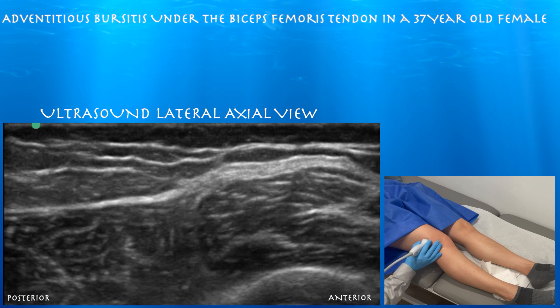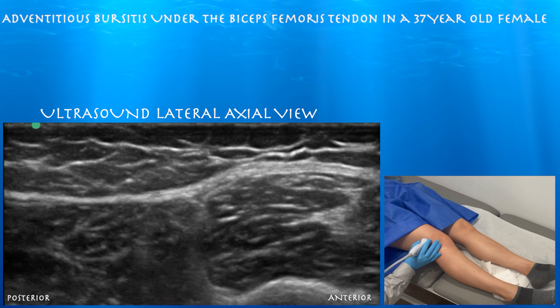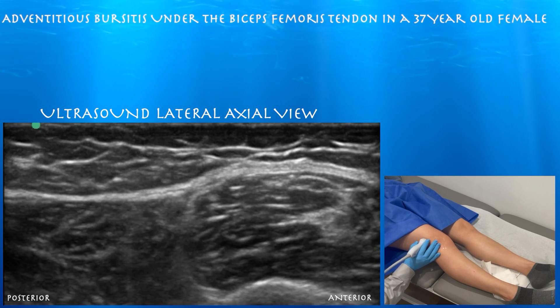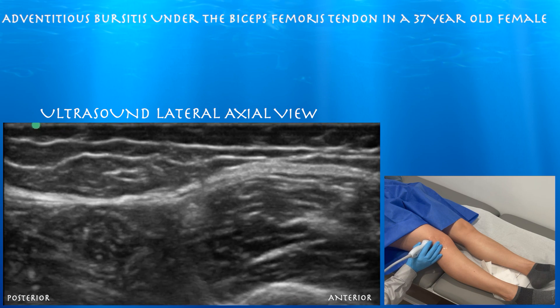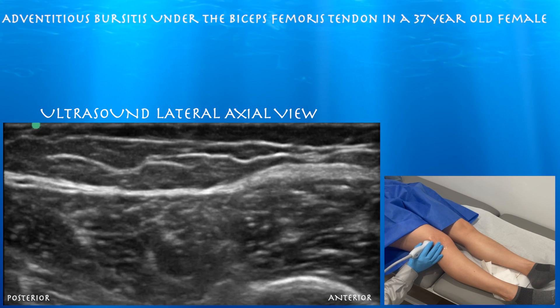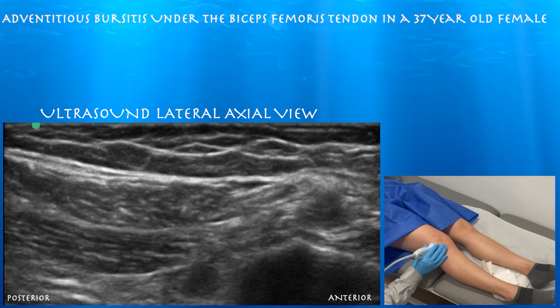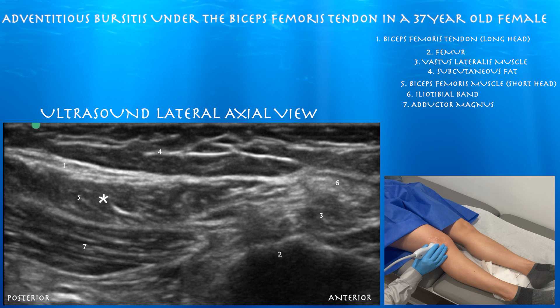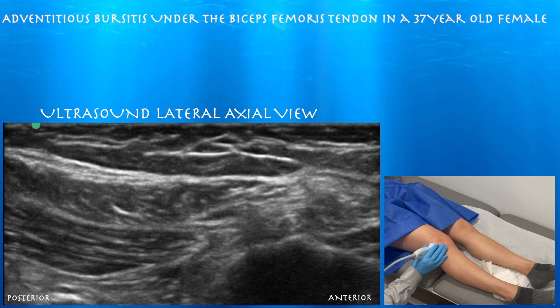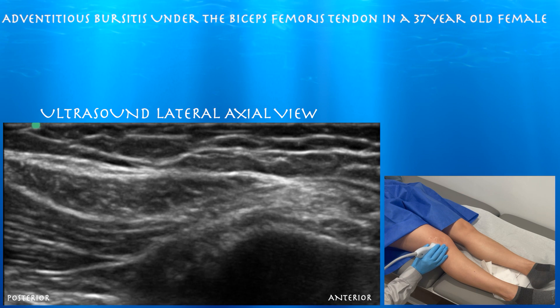Now we're trying to see the ITB and the biceps femoris at the same time. Going down the thigh, you can see how the tendon is starting to form — at least the biceps femoris long head — with the short head muscle underneath that. Deep to that you have the adductor magnus muscle. You can appreciate how the fibers are going in a different direction in the adductor muscle versus the biceps femoris.